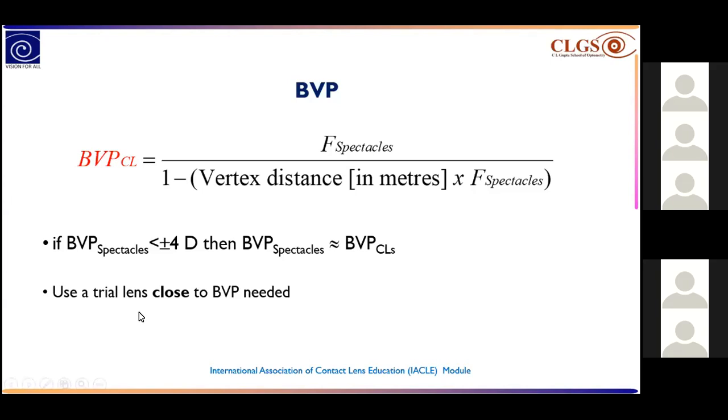And always we have to choose the trial lenses of the contact lenses which is close to the back vertex power of the spectacle.